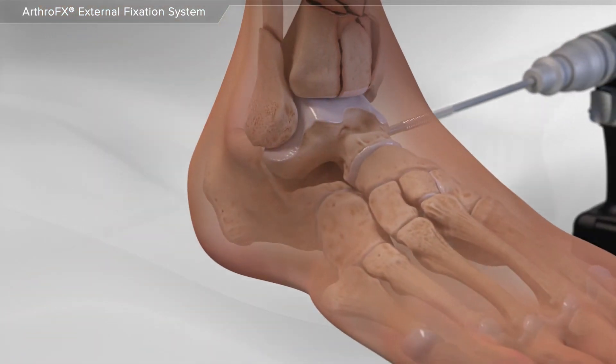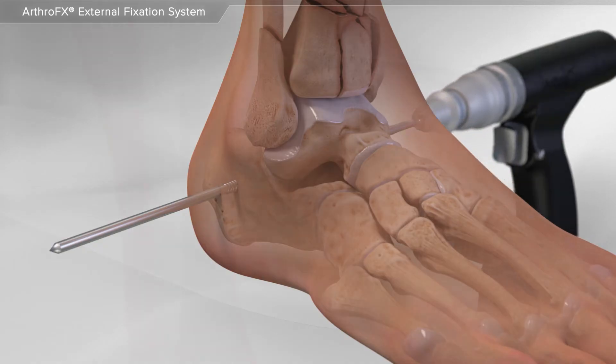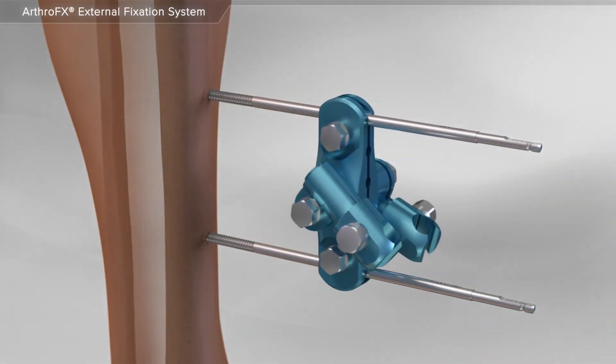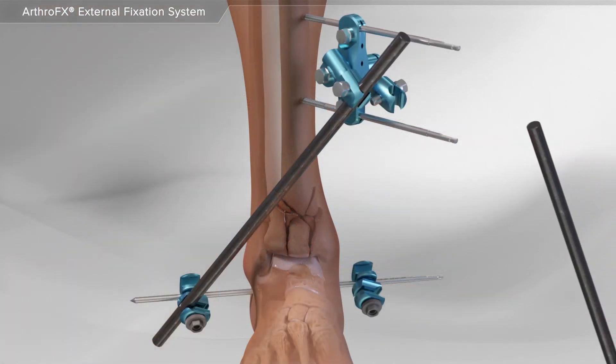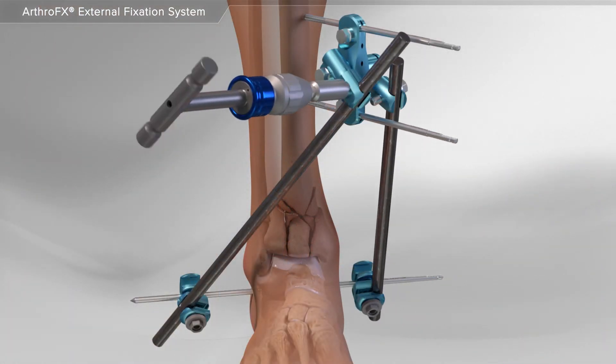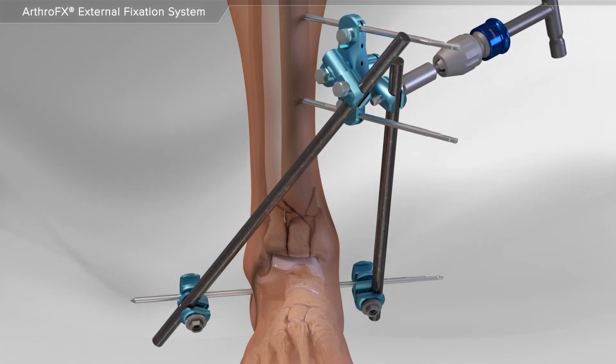Next, an additional pin is placed through the heel bone below the level of the fracture. A special clamp is placed onto the two pins and secured into place. Additional clamps are placed onto the pin in the heel bone, and then carbon rods are connected between the clamps.